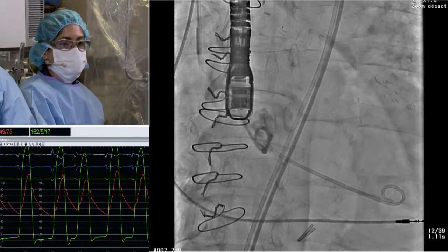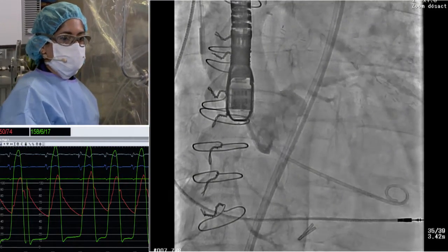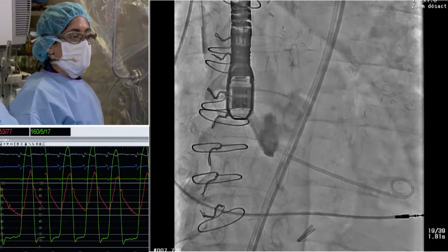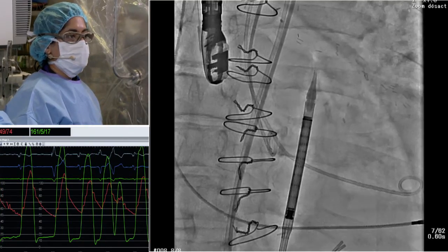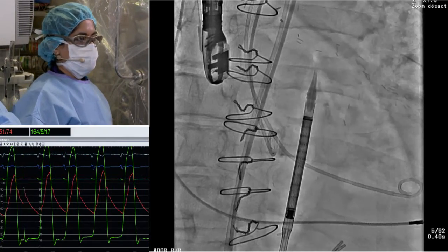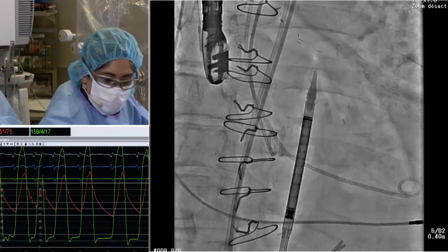This is our view as determined by fluoro-CT. So we have nice alignment. This is going to be our implantation view, with some adjustments depending on what we see with the device. And if you could just show the fluoro check of the Evolut, please. Can we just go to the next cine? So here we've just done the fluoro check of the Evolut 29. You can see that that's loaded correctly. So I'll let JF describe the equipment that we're using, and we're just going to go ahead and put our wires in place.